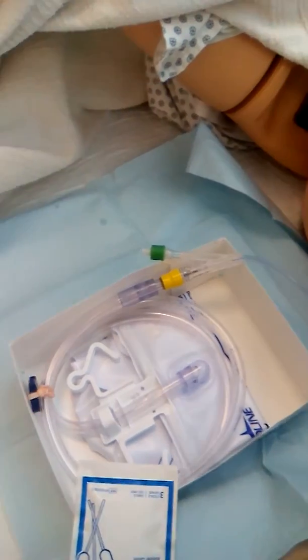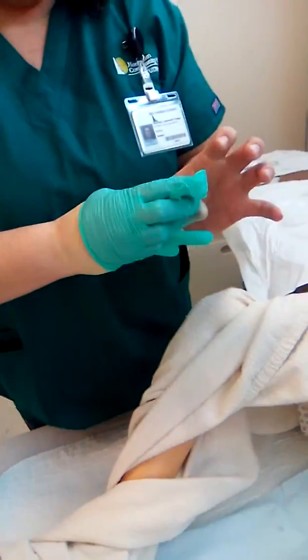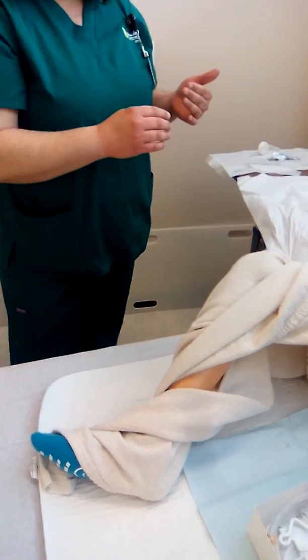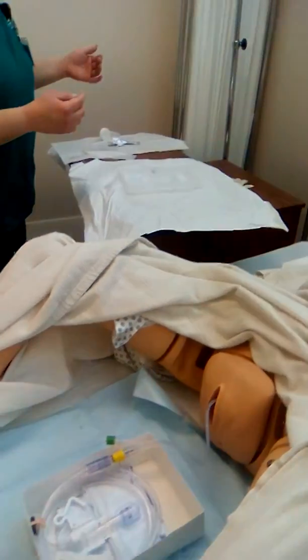Then I would remove my sterile gloves. Perform hand hygiene. Reapply gloves.